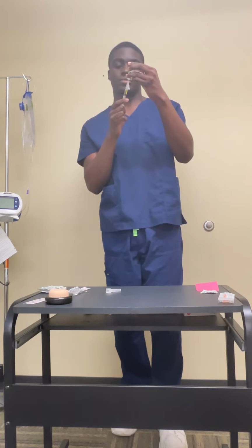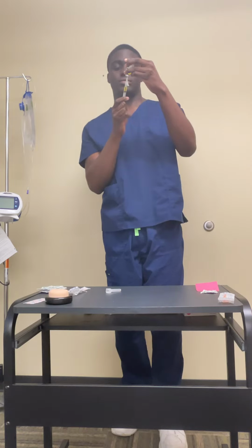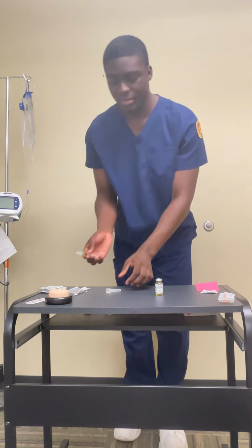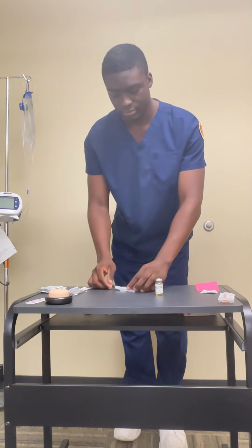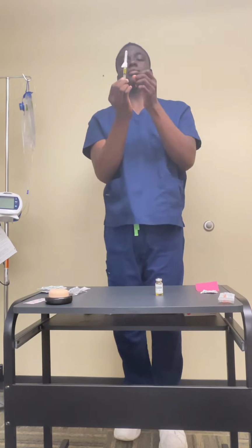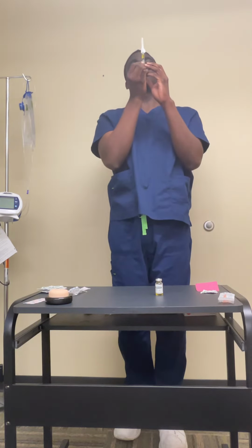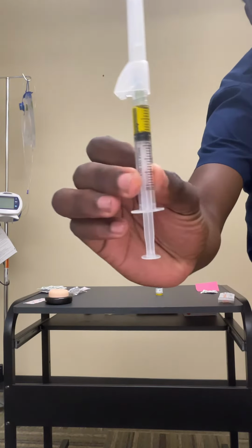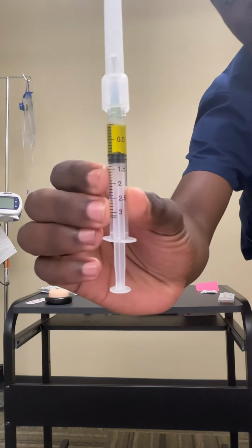Ensuring I don't have any air bubbles. Recap my needle.